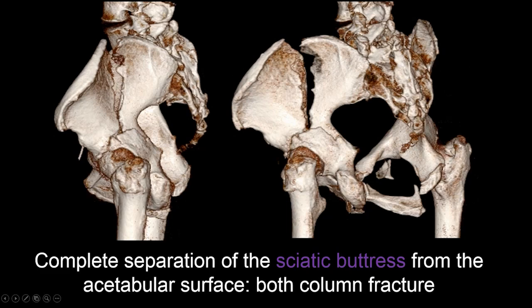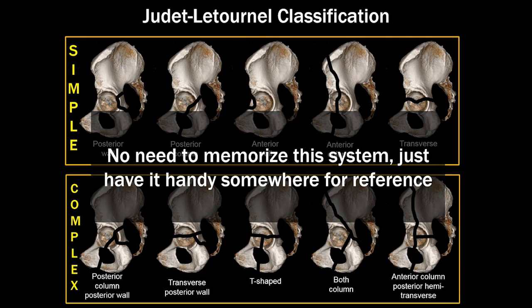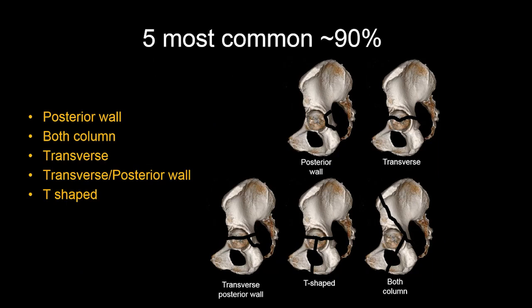On a 3D image, you can confirm: from the sciatic buttress, you cannot reach the acetabular articular surface without going through fractures — this is a both-column associated acetabular fracture. There's no need to memorize the Judet-Letournel classification system; just keep it handy for reference, especially when first learning. For your interest, here are the five most common fracture types — and at this point you have actually seen all ten Judet-Letournel fracture types.